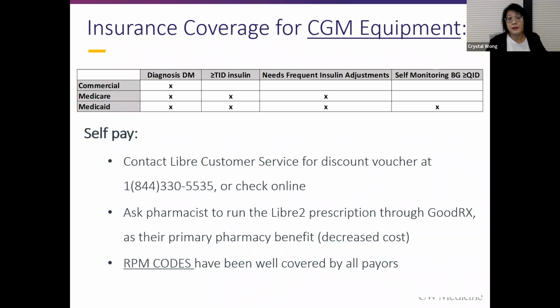So, I think that this will change. I think this is becoming more and more the standard of care and widely accepted. And I think Rick sent out a really good set of articles that was put together by Earl Hirsch, who's a diabetologist here at UW, looking at the evidence. Uniformly for patients on insulin, CGM has really shown improvement in A1Cs. In patients who are not on insulin, there's a bit of a mixed bag of evidence.